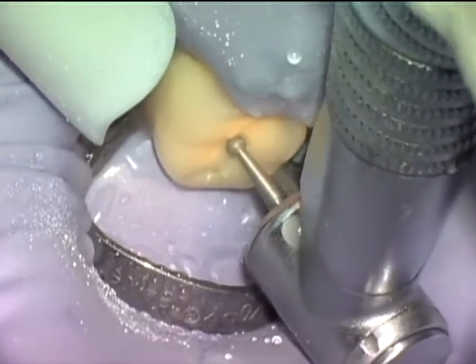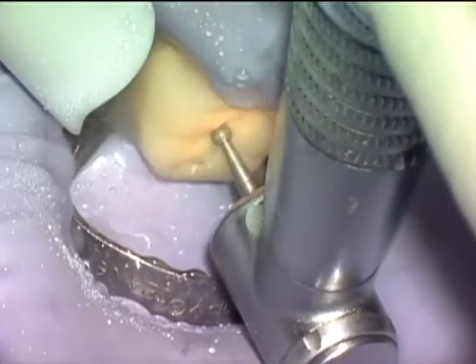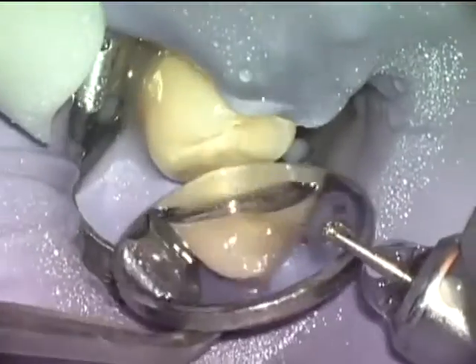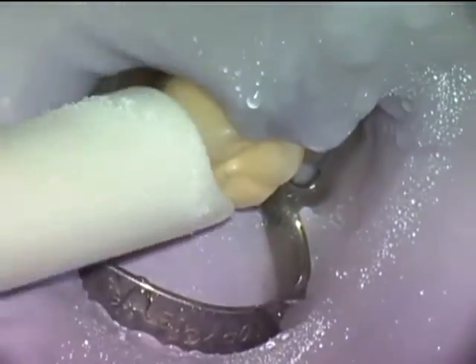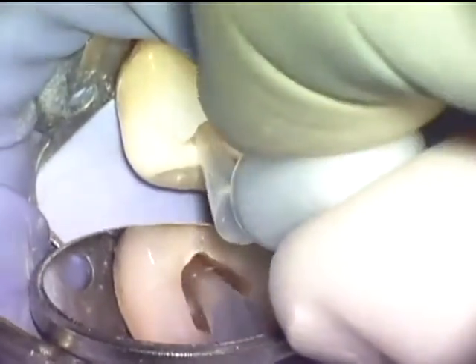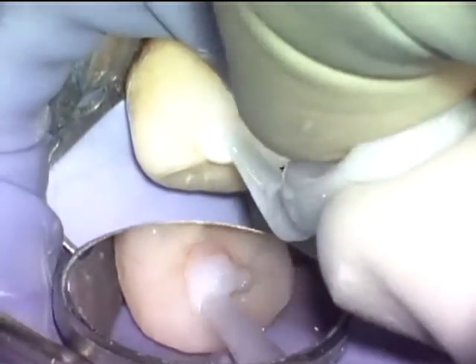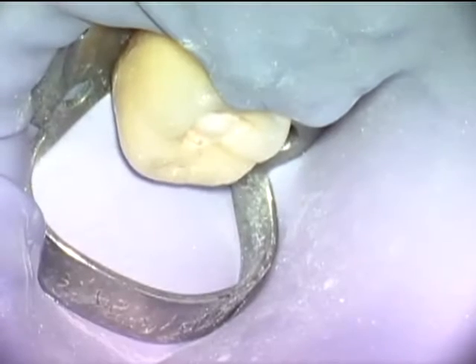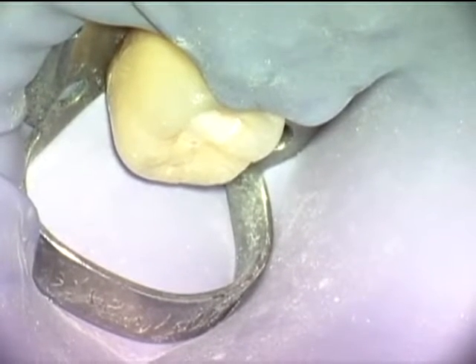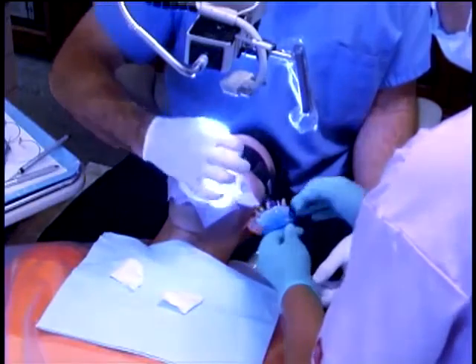Access is initiated from the central fossa of the tooth towards the mesial. An ideally cut access allows us to fill the cavity with ProLube lubricating solution and still easily drop our negotiating files into each canal orifice. This placement of ProLube in the access cavity results in efficient prevention of apical pulp blockage during negotiation procedures.